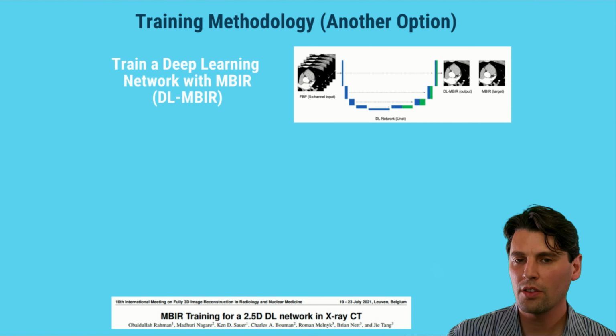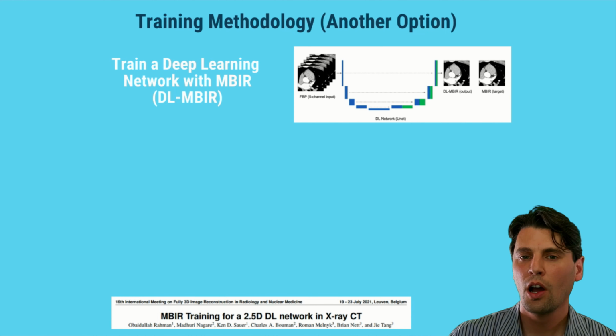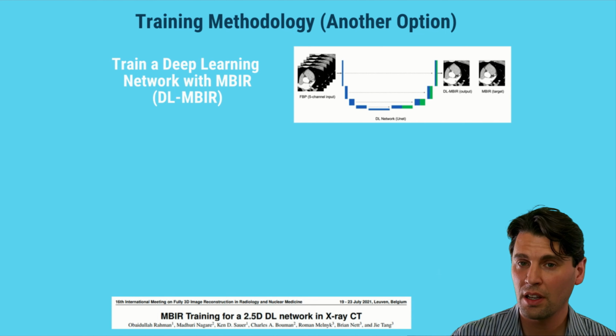We also wanted to note that early on, and then again recently, we've looked at the ability with our collaborators at Notre Dame and Purdue, we've looked at the ability to just reproduce model-based iterative reconstruction, but to do it quickly.